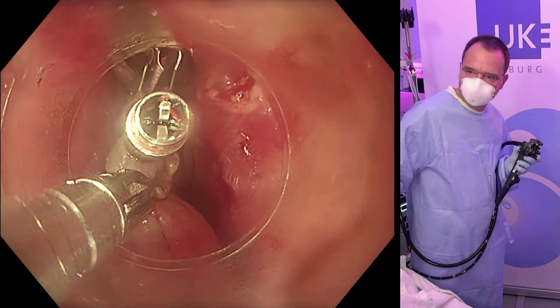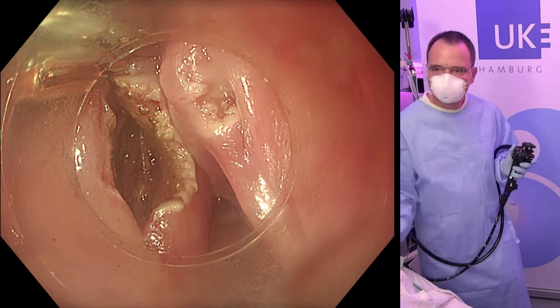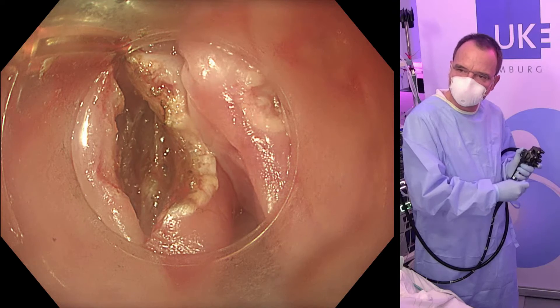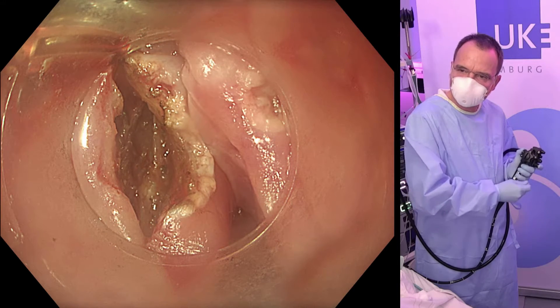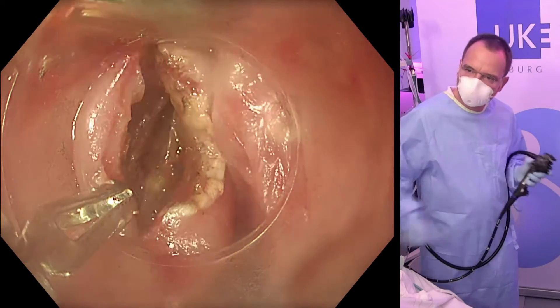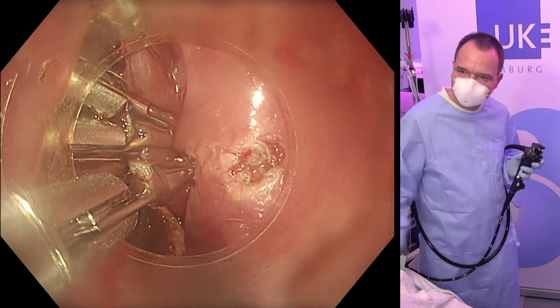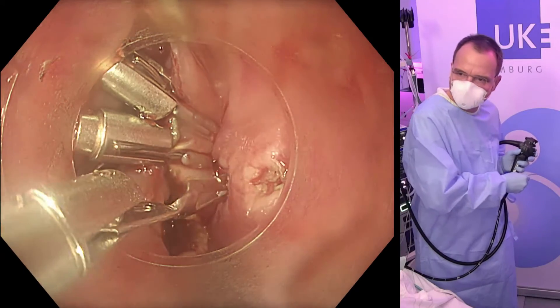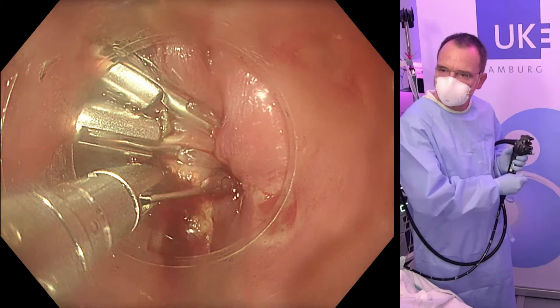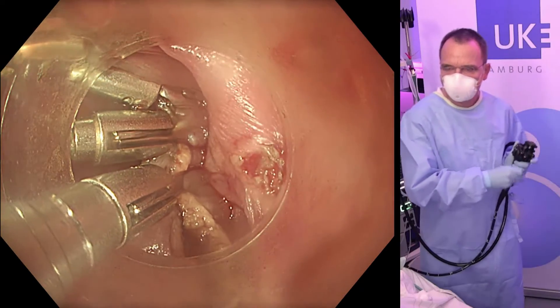As you can see here, the clipping is extended. This is the remaining pocket, and to avoid pocket creation the entire opening has to be closed. We use various clips depending on the situation — various sizes and specifications. Here the clip is placed over the opening, closed, manipulated, and then finally fired.